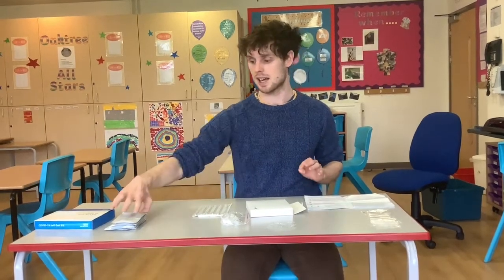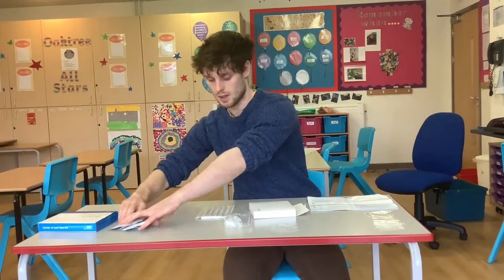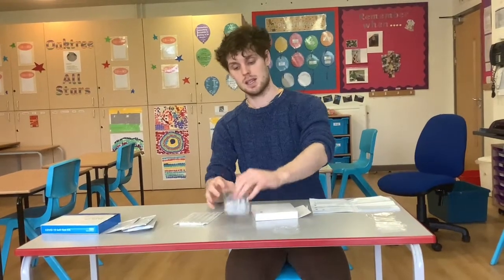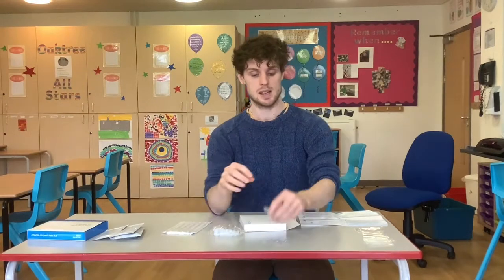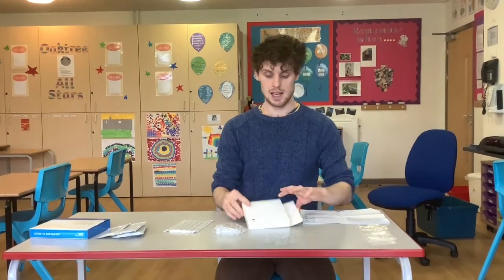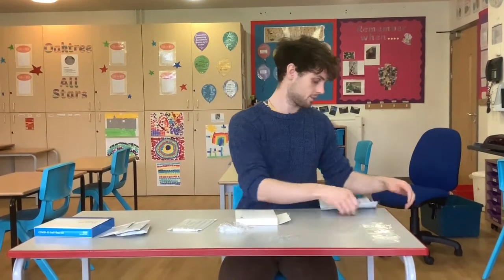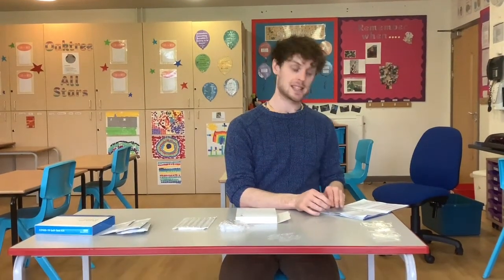In the test kit you should have these white sachets which contain the test itself, these long cotton swabs — seven of each thing — seven test tubes, seven little sachets with testing fluid in them, seven waste disposal bags, and a white cardboard box with a hole in the bottom left-hand corner. You want to clean the area to make sure it's not contaminated, and then wash your hands thoroughly for 20 seconds.